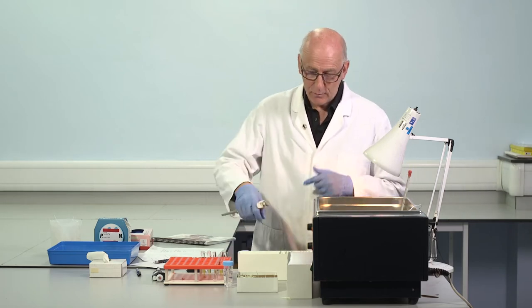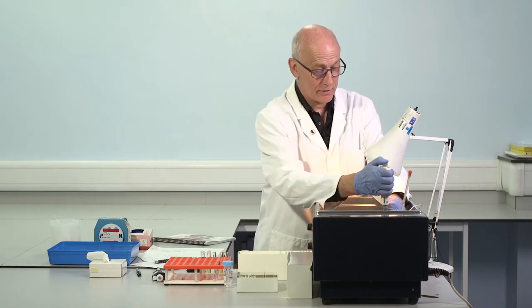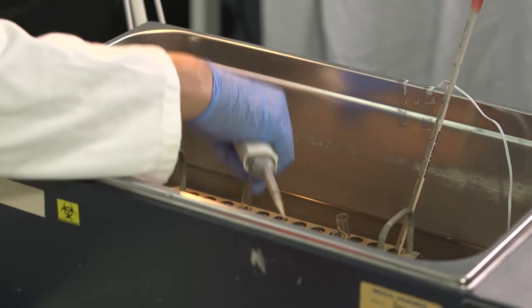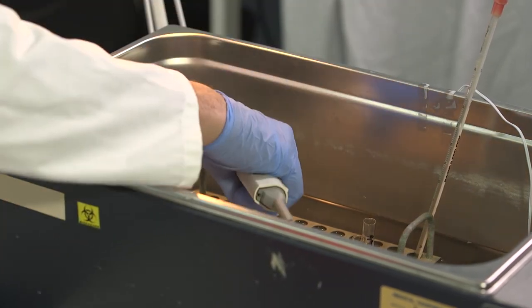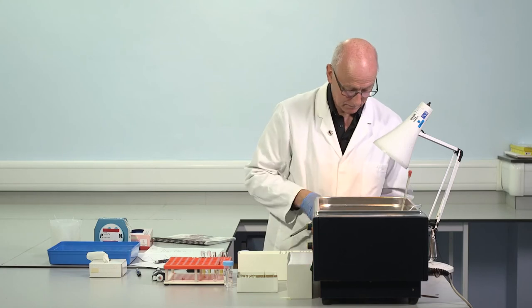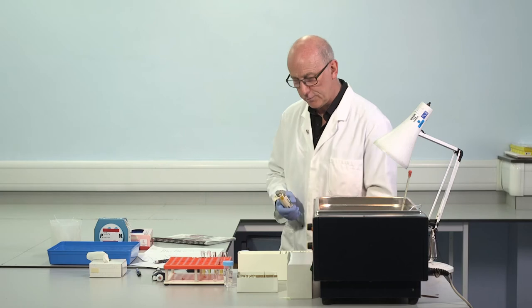I'm going to start the activation whilst we're talking. APTT reagent, first sample, first replicate, APTT reagent, second replicate, started the clock, 3 minutes. So it's important to use healthy normal subjects.